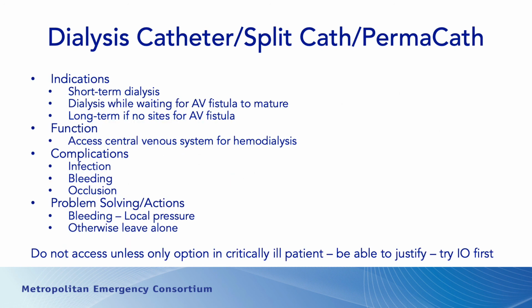So what do you do? If there's bleeding, local pressure. Otherwise, leave the device alone. If it's partially fallen out, leave it alone. So really for you, it's a little bit of bleeding, local pressure, leave it alone.